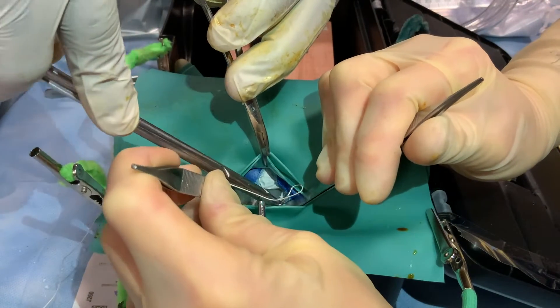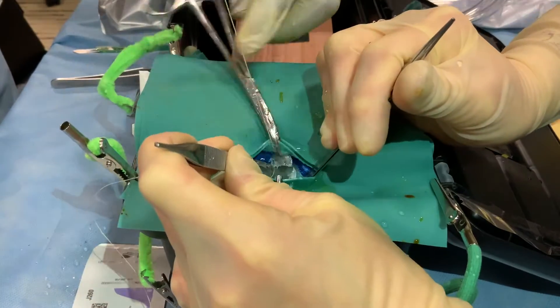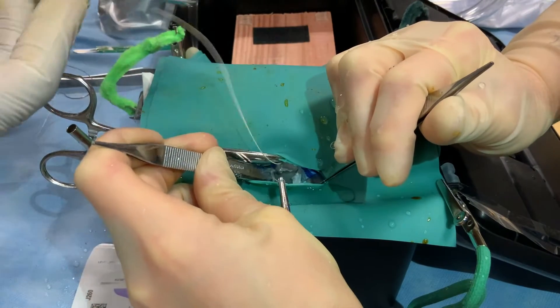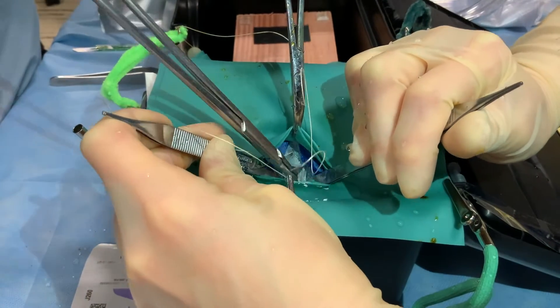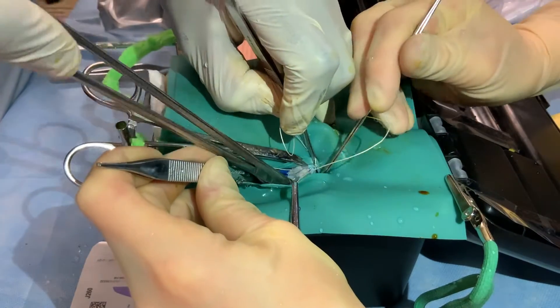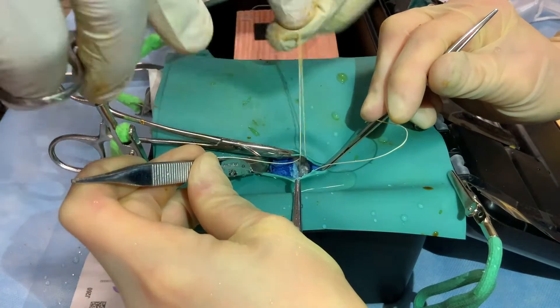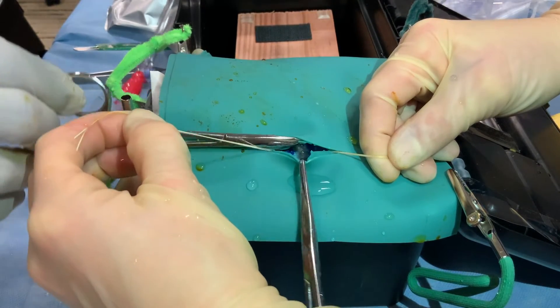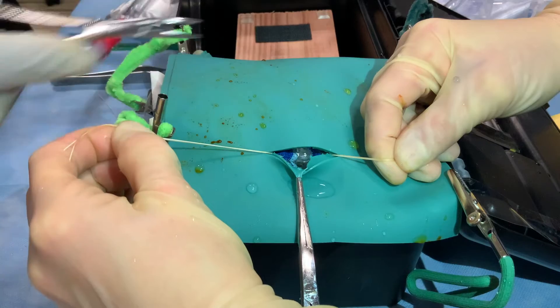The surgeon then places two stay stitches through the visible bladder wall, going in the inferior to superior direction on either side of the midline. These stay sutures help the surgeon retain control of the bladder during catheter insertion and can be held by the assistant or clamped to the surgical field. Clinically, 0 or 2-0 monofilament would be an appropriate choice, but any suture can be used for simulation. The surgeon can then aspirate with a 5-milliliter syringe to confirm they draw back urine, ensuring they are indeed entering the bladder before making the incision for catheter insertion.